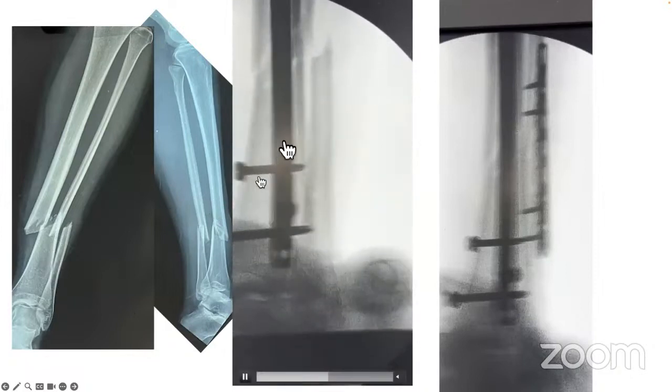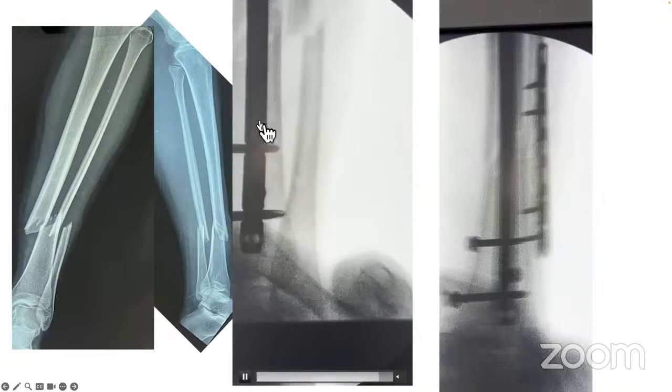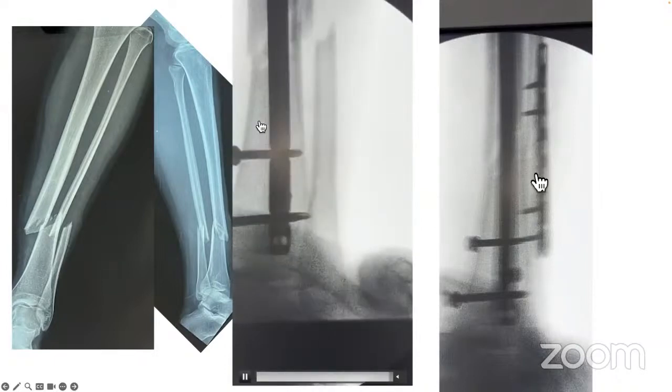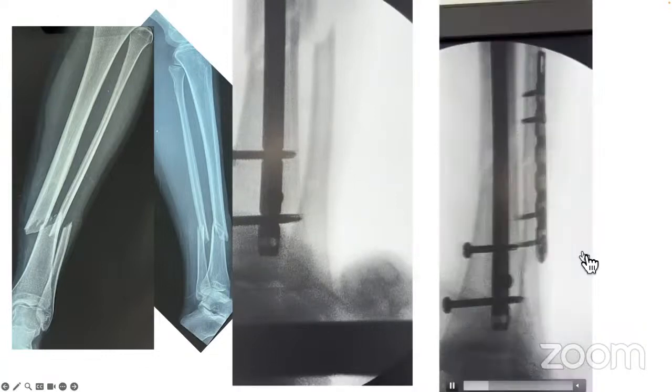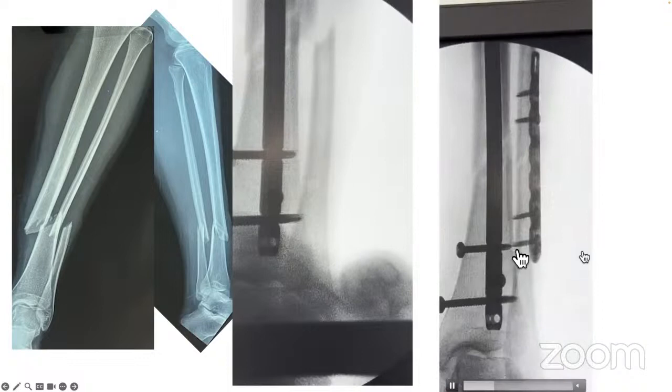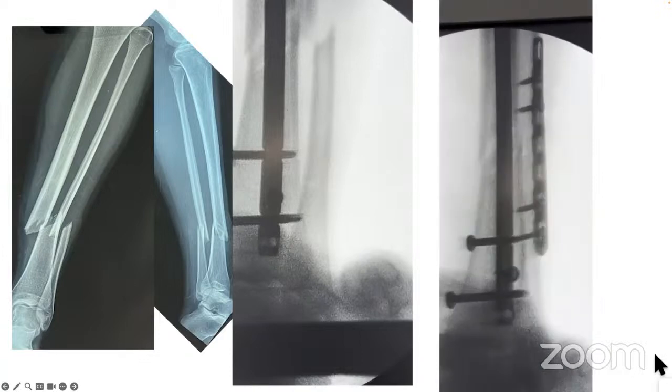You can see this is the video before the fibula plate. There is a movement occurring, so I put in the fibula plate. And I thought it would still be stabilized. But you can see this. Still I felt it wasn't stable. So I added a plate.